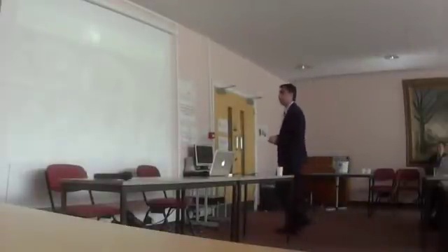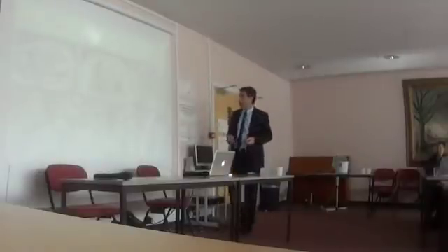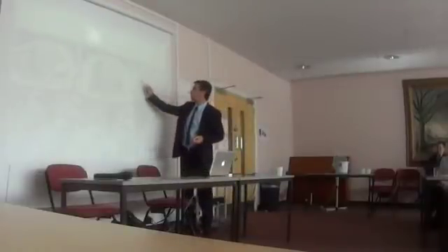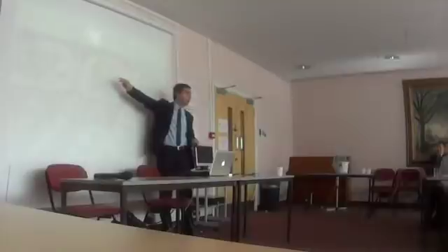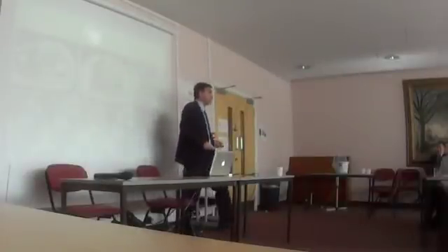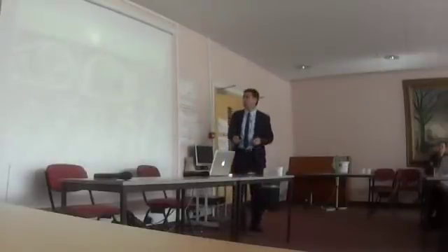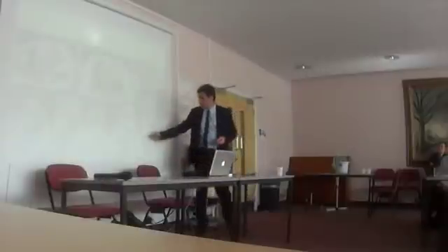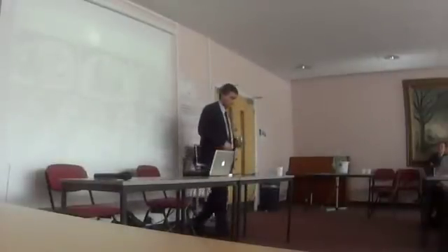The next step, apart from these beautiful pictures that we took, was to look at the gadolinium scar. The scar you can see here is the white within the black. The black is the muscle and this is the white, and the white is almost bigger than the black. So this is a gentleman who, unknowingly, at some point suffered a massive MI, which blocked one artery. And if you look at this, it goes all the way right to the tip of the heart.